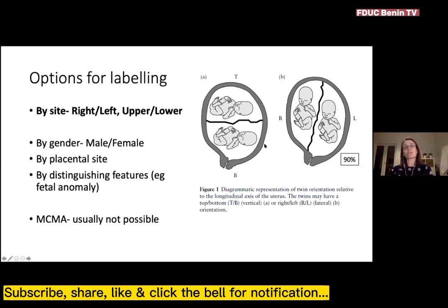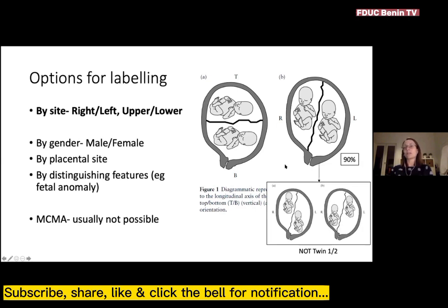The reason that it's so important to label them like this, as opposed to the more old-fashioned way of labeling them as twin 1 and twin 2, is that twins who are situated on the left and right can actually switch which is the presenting twin quite easily.